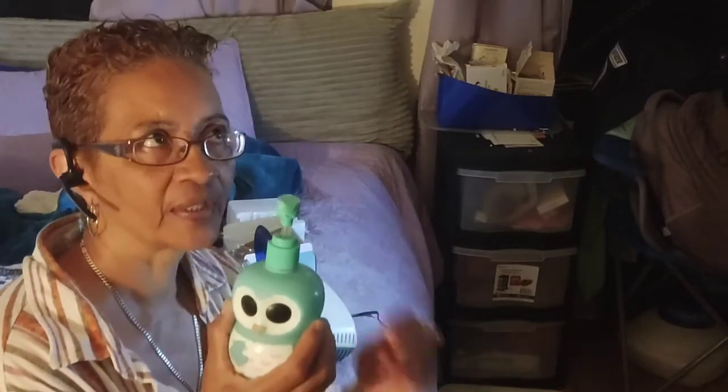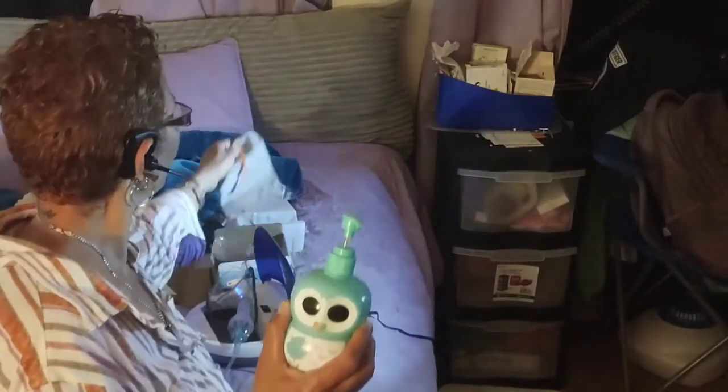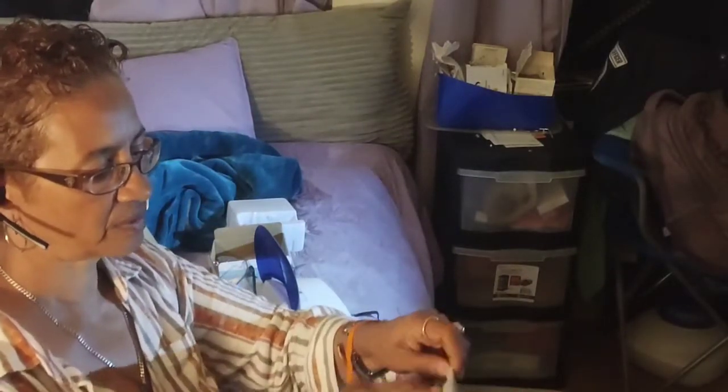Carry the individual alcohol wraps, okay? You know what I'm talking about, those little packets. So you can wipe the mouthpiece, sanitize it and put it back into a case. It didn't come with a case. Oh, yes, it did. Here it is, guys. Yes, it did. I'm talking crap over here. Here it is.